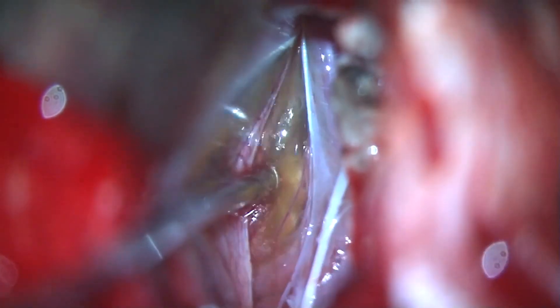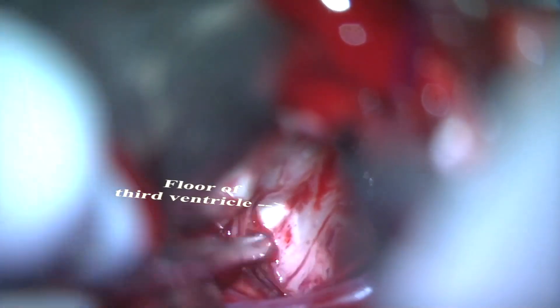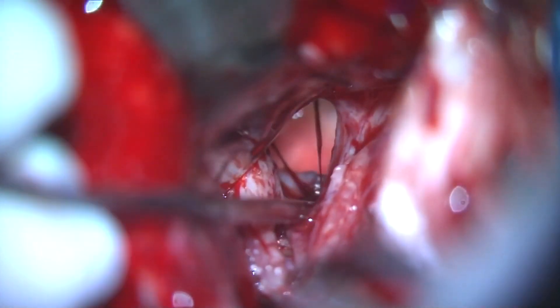Direct access to the posterior wall of the cyst is now achieved, and it is initially drained to relieve its mass effect. The capsule is then circumferentially dissected and peeled from surrounding structures, preserving arachnoid planes. The capsule is gradually dissected and at some points incised to decompress the solid component related to the mural nodule. The capsule is detached from the floor of the third ventricle, which is also preserved and decompressed. The inferior, anterior, and superior projections of the mass are gradually dissected, and cyst drainage at the outset allowed safer and more accurate circumferential dissection.